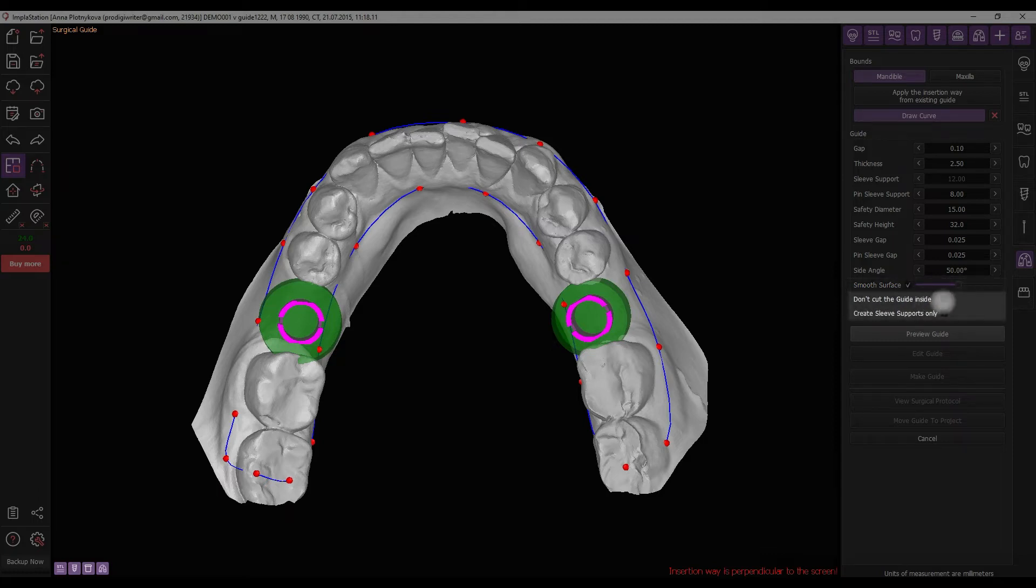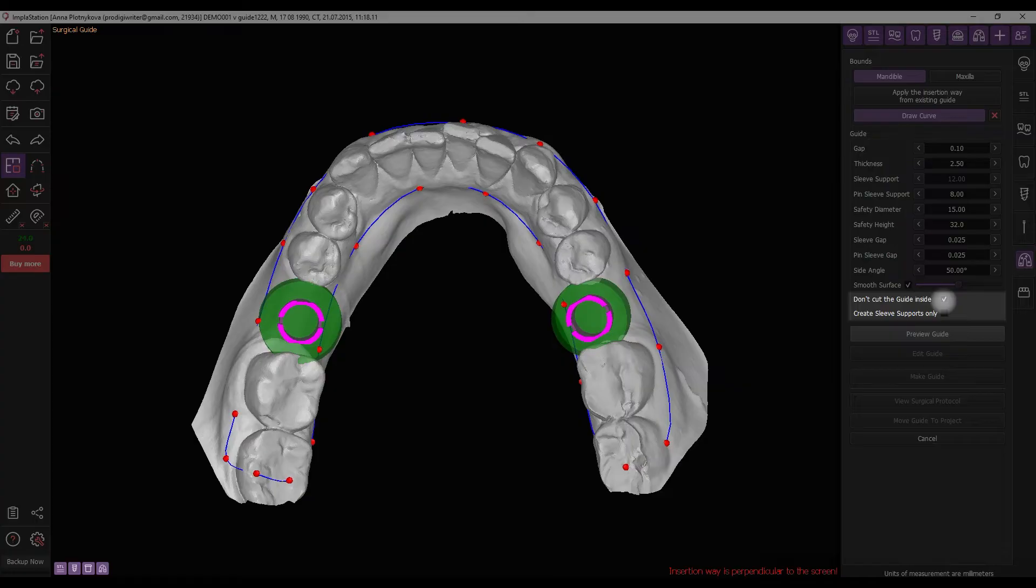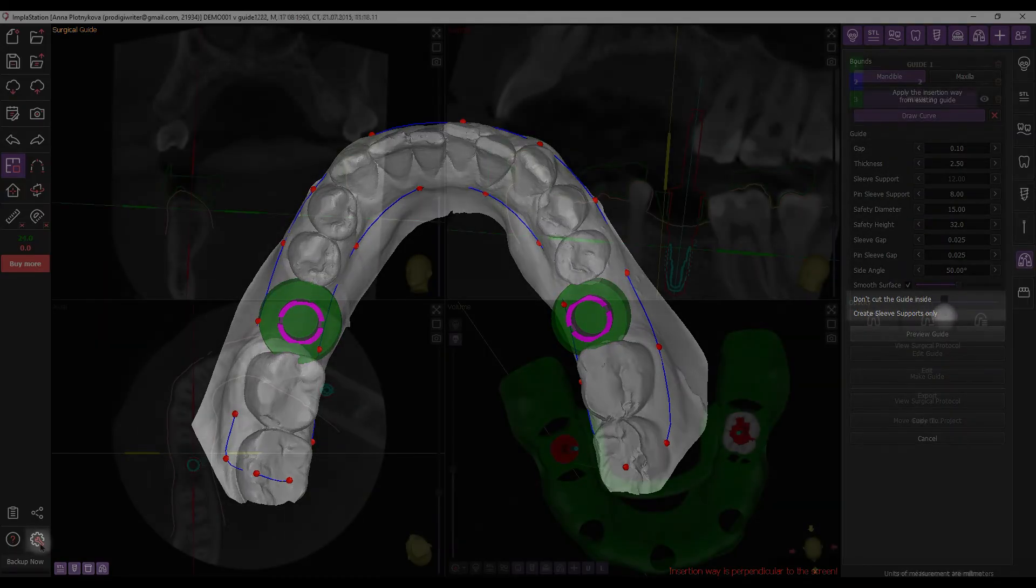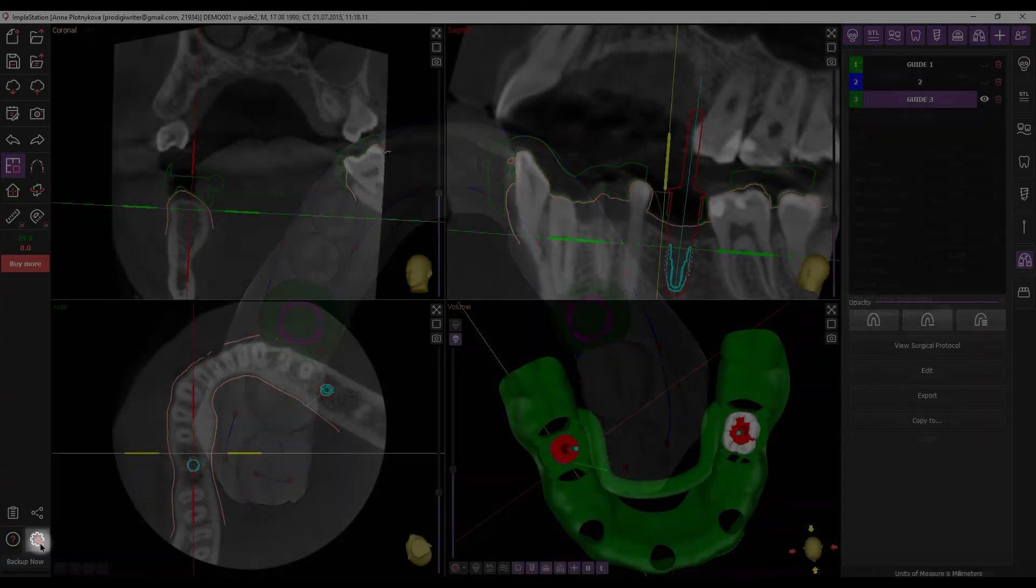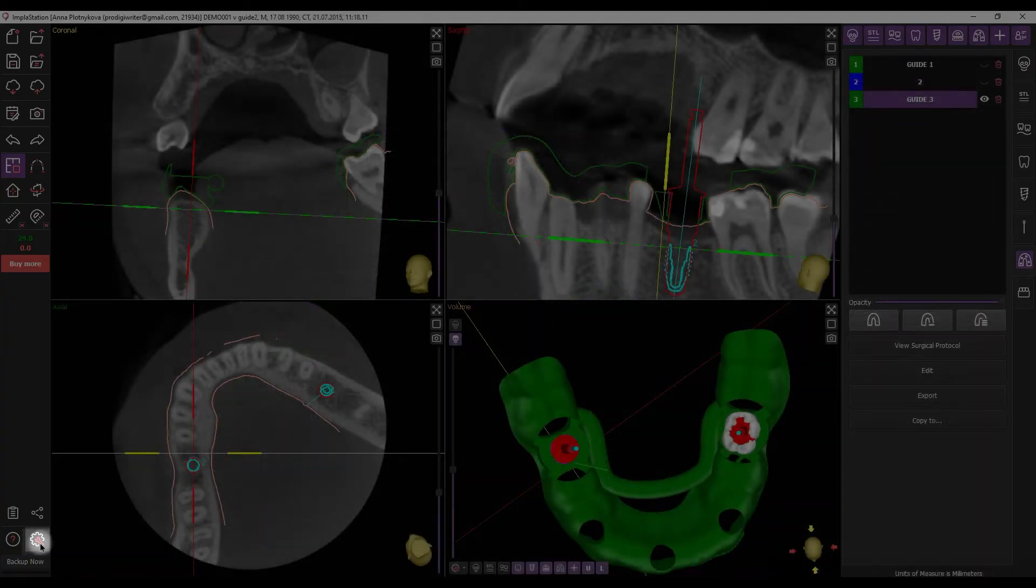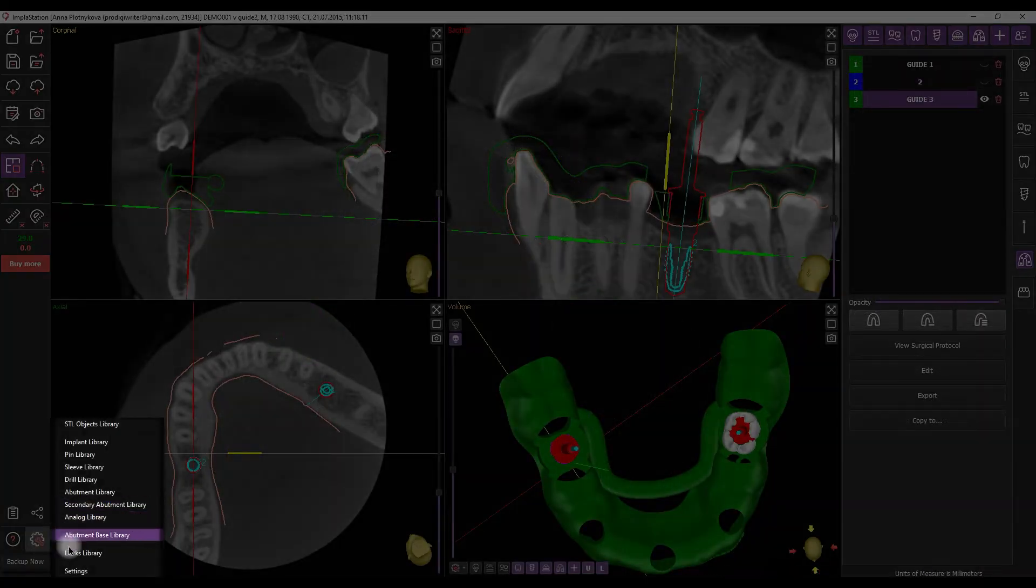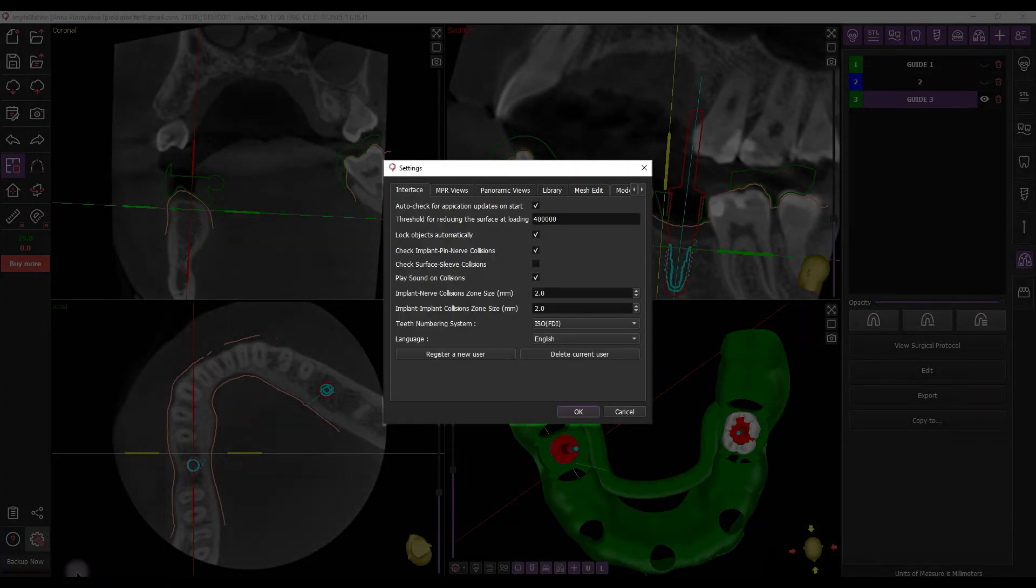In certain cases, selecting the option Don't cut the guide inside may be appropriate. If you only need to create sleeve support guides, check the corresponding feature. Most of these parameters can be set by default in the Implastation settings menu.